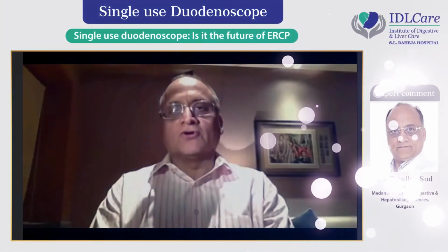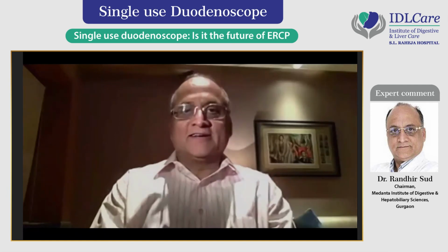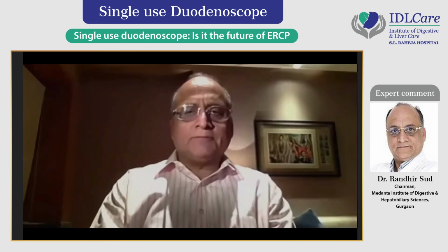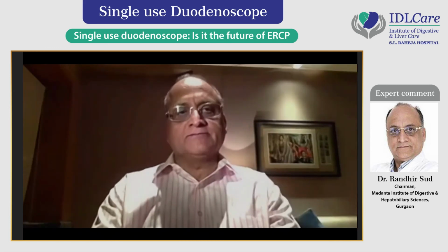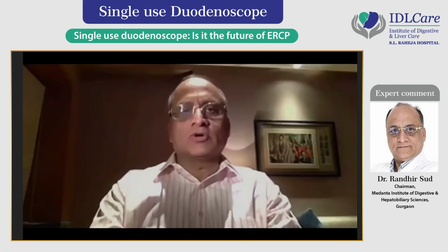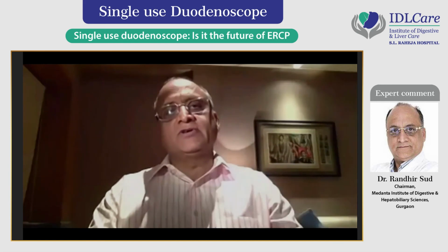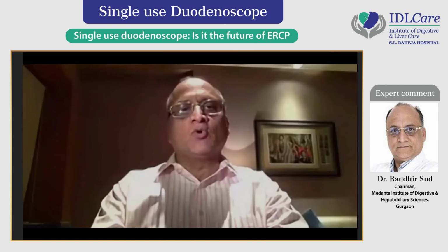And first of all, congratulations on this seminal event. Mohan has covered the entire topic very extensively. To my mind, there's no doubt that we do need a better sterilization system to prevent infection in our patients who require ERCP. There's no question about that. What we have to debate is whether single use is the only answer, or whether evolving technologies which will make reprocessing better are going to be less expensive and more affordable.